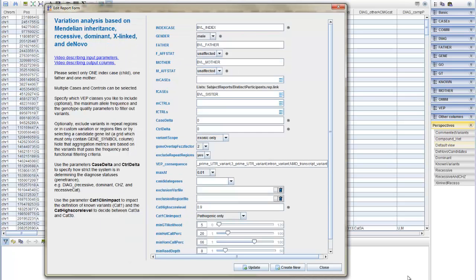Or, as an example of the utility of this function, here is the case of 2 sisters with the identical phenotype as well as their unaffected parents. In this case, I might decide to alternate which of the 2 sisters the analysis uses as an index case. Here I would create new.